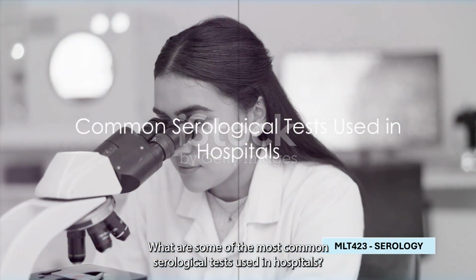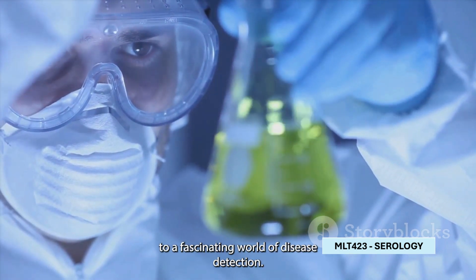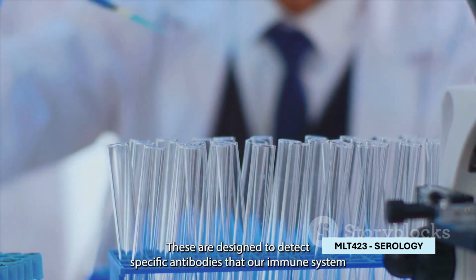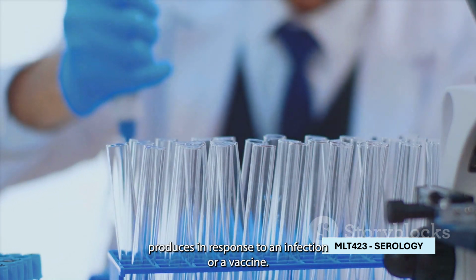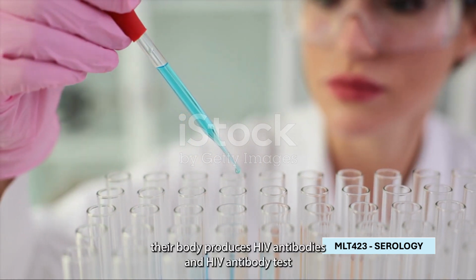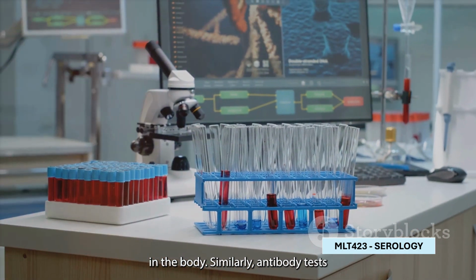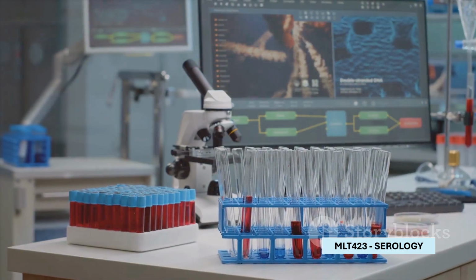What are some of the most common serological tests used in hospitals? Now that's a question that opens the door to a fascinating world of disease detection. Let's start with antibody tests, also known as immunoassays. These are designed to detect specific antibodies that our immune system produces in response to an infection or a vaccine. For instance, when someone is exposed to the HIV virus, their body produces HIV antibodies. An HIV antibody test can detect these antibodies and confirm the presence of the virus in the body. Similarly, antibody tests are used to diagnose diseases such as hepatitis B and C.